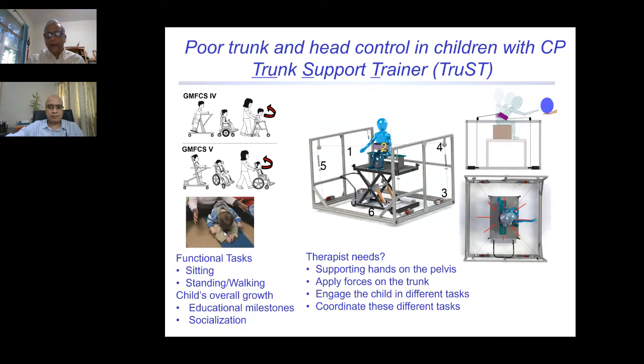If you think of, let's say, this individual who is behind the child, he can, at the most, help stabilize the child in a vertical position, right? So that's good. The therapist has two hands, right? But now if I had to think about training of the child, training the functional task of the child, you really need many hands, right?